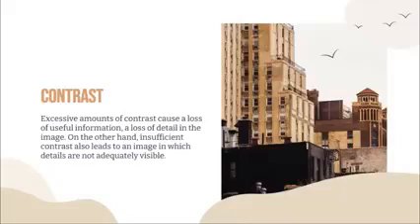On the other hand, pag kulang ang imong contrast, dili na kaayo siya klaro ang detalye. Okay? So dapat ang button ninyo is nalang ta sa middle, which is the optimal contrast. If there is barely any difference between two adjacent shades of gray, it will be difficult for the human eye to detect that there are indeed two shades there. Okay, so limited lang man po ang capacity sa ato ang eyes. Therefore, you should provide a contrast that is of optimum value. When these shades of gray cannot be distinguished from each other, information is again lost.